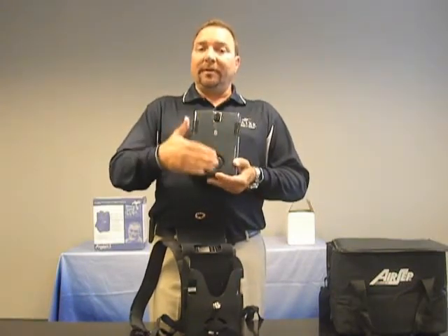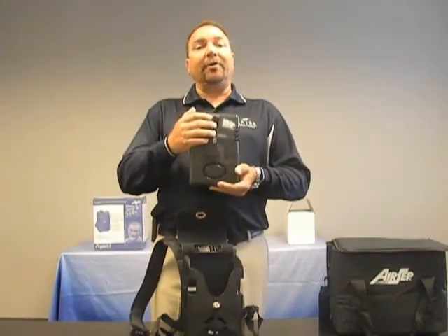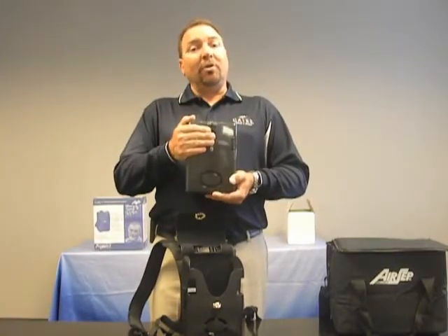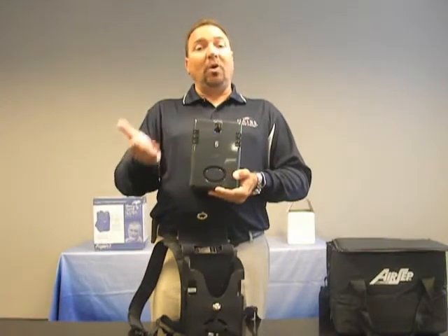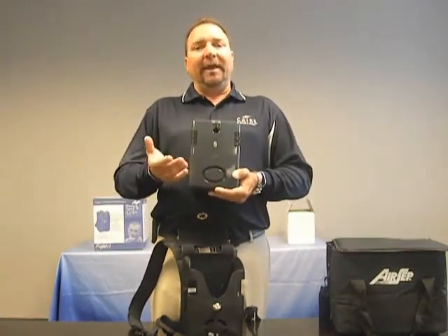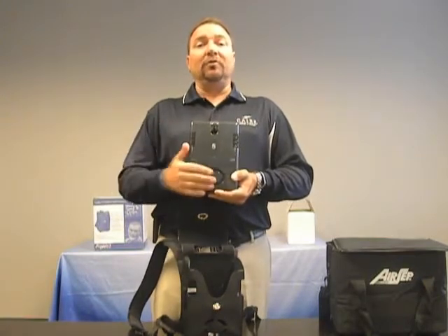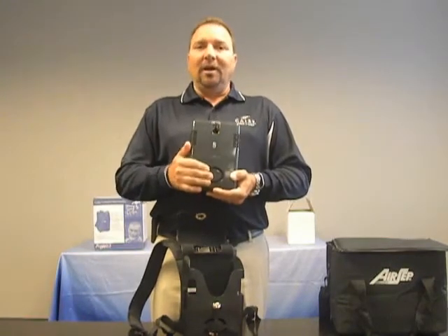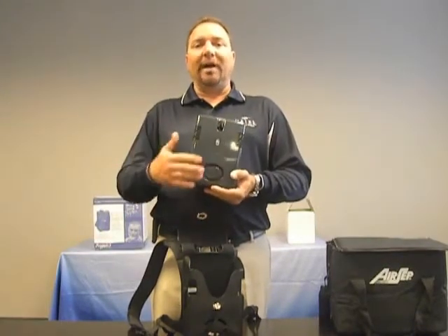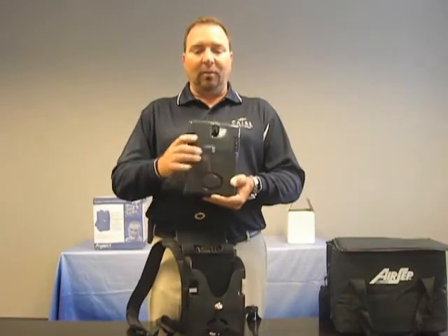Directly up from the gross particulate filter you will see an area where you can connect your oxygen tubing. The Freestyle portable oxygen concentrator uses what we call Ultrasense technology, which is extremely sensitive, allowing the patient to use up to 25 feet of supply tubing. This is a nice benefit if you want to set the device down and have the ability to move around without carrying the Freestyle with you.